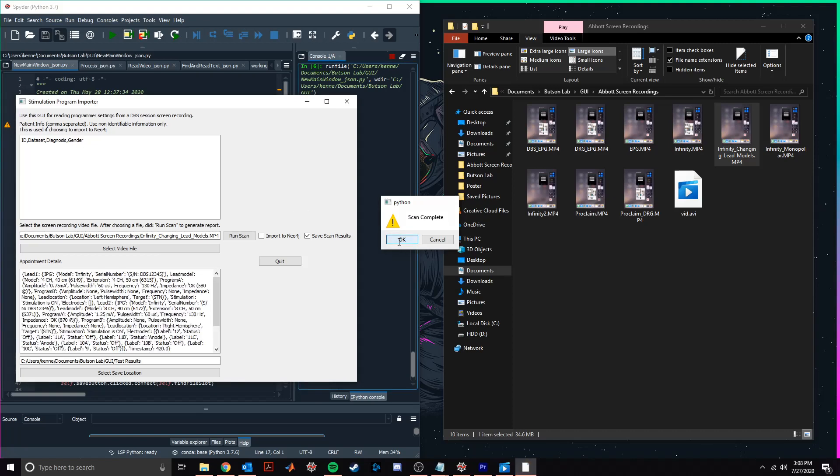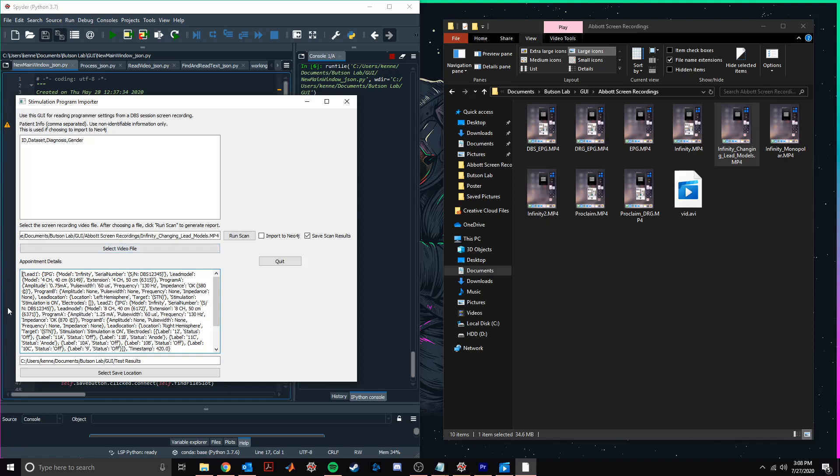All right. Our scan is completed in about four minutes, and after confirming we'll see that the appointment details have been updated to display the last settings sampled from the device screen recording.